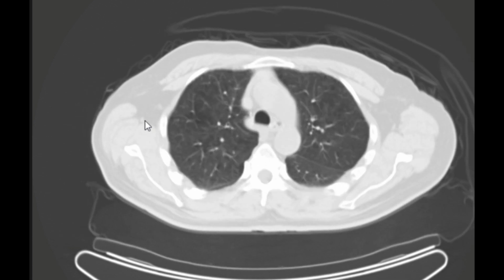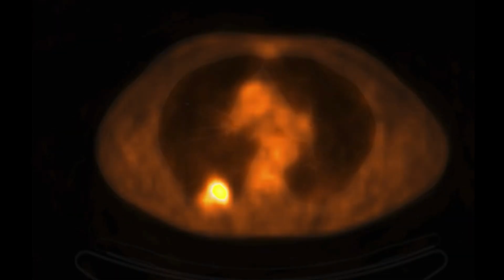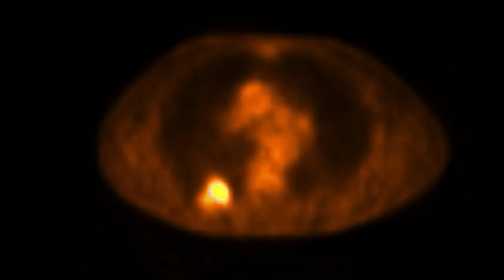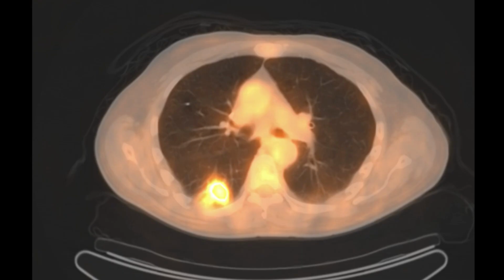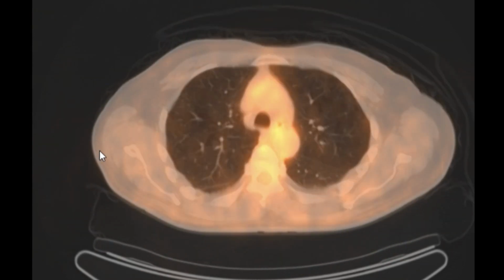Let's scroll back, find it. Okay, so there we go. This is what we think is tumor. Let's look at the PET scan now for this. So it's fused. You see the resolution of the PET scan is quite a bit worse than the CT, right? But you have this fusion that helps you visualize. So the tumor uptake there is well visualized in this patient.